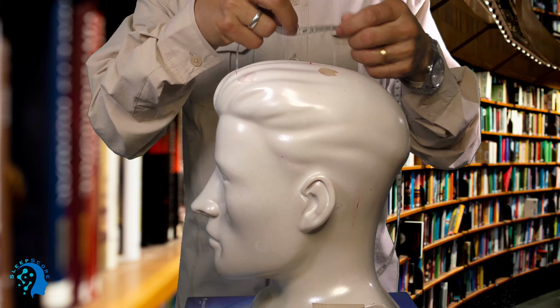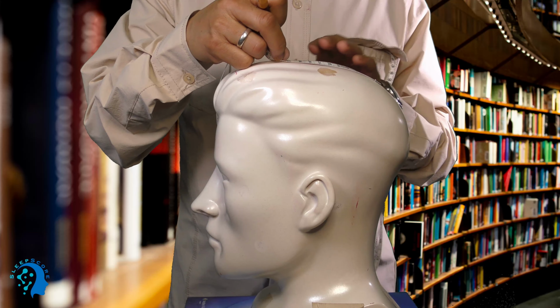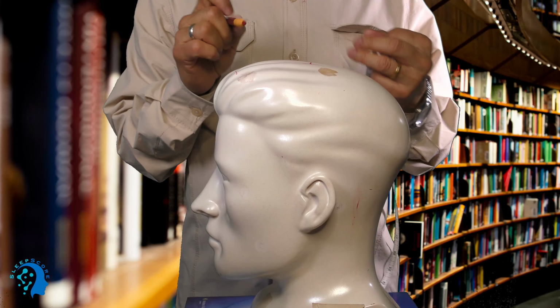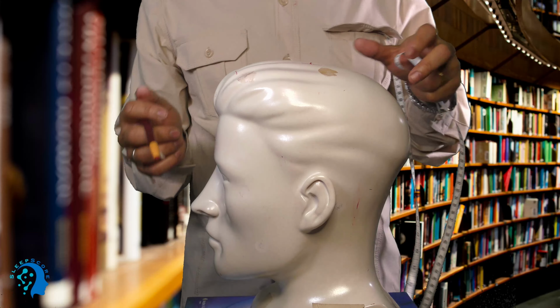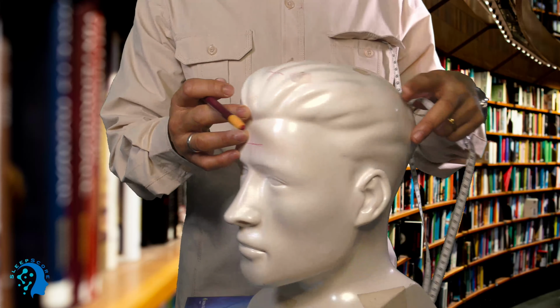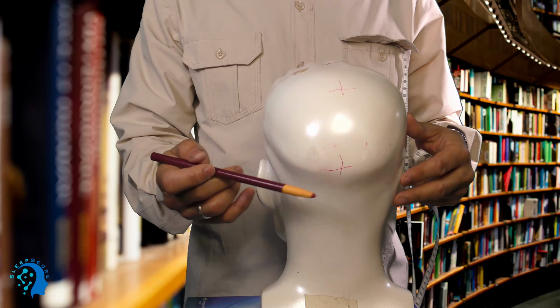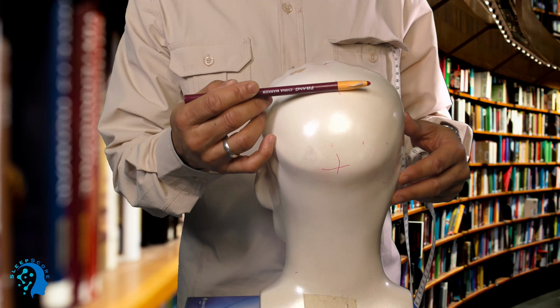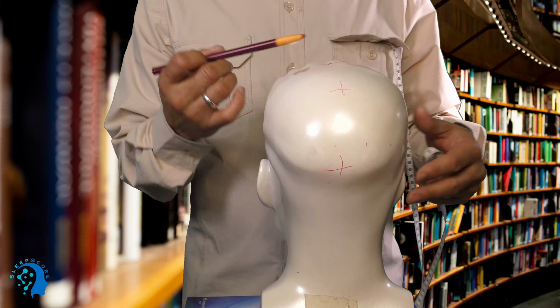7.6, and I'll go the other side also, 7.6. So I took 20% from this side. Or if you measure from here to here, it's going to be 20% too. Now the first thing, this became like 10% and then 20% and 20%. So in the same way on the back, from Inion, this is 10% and then you go 20% and it goes 20%.